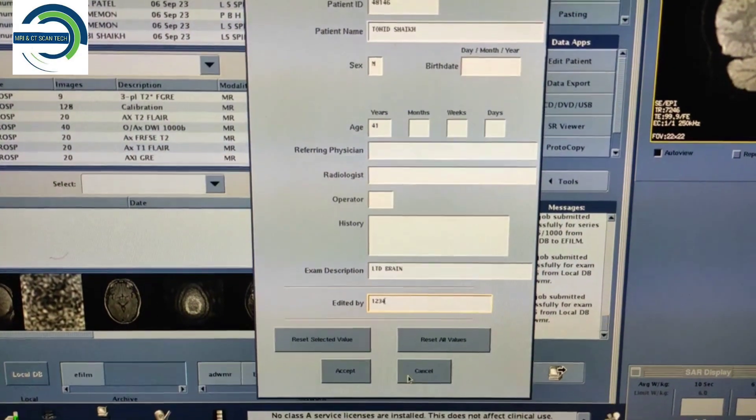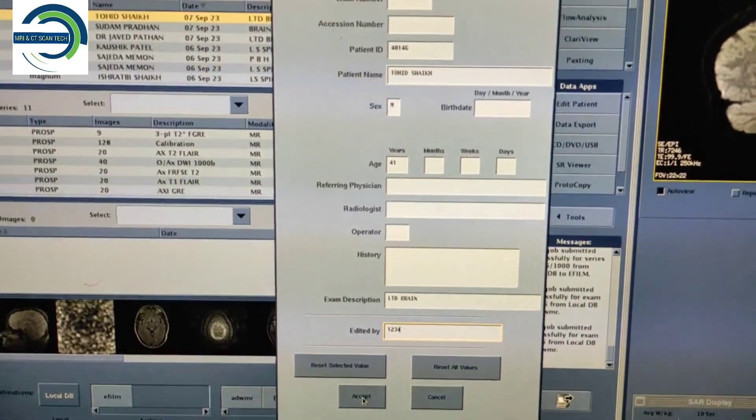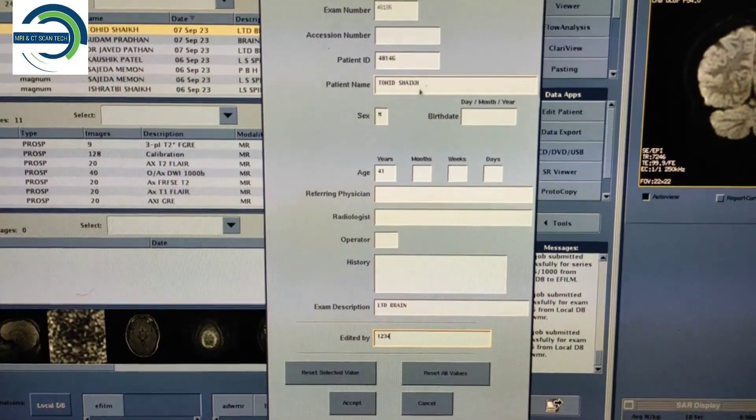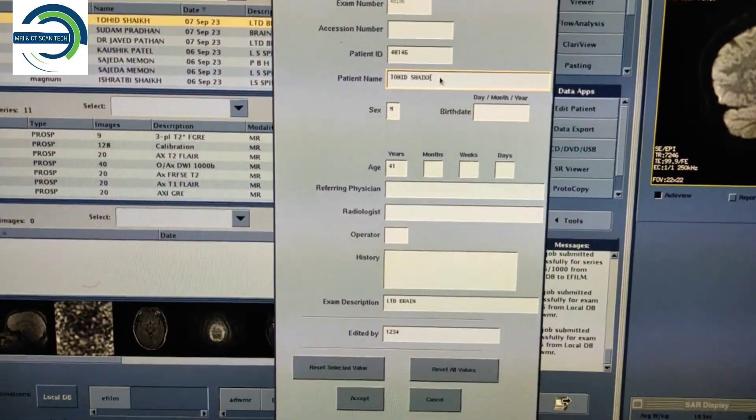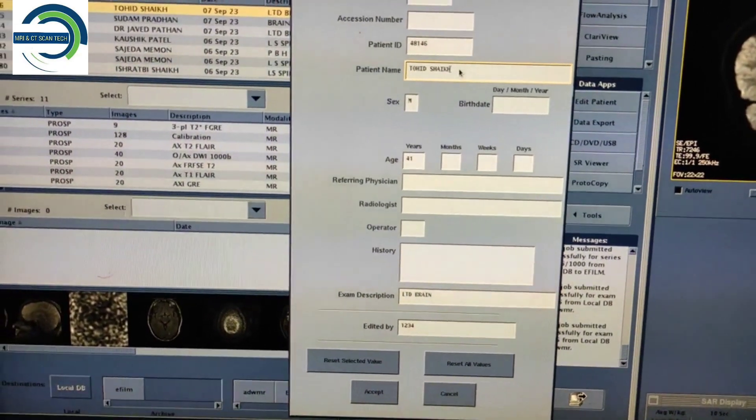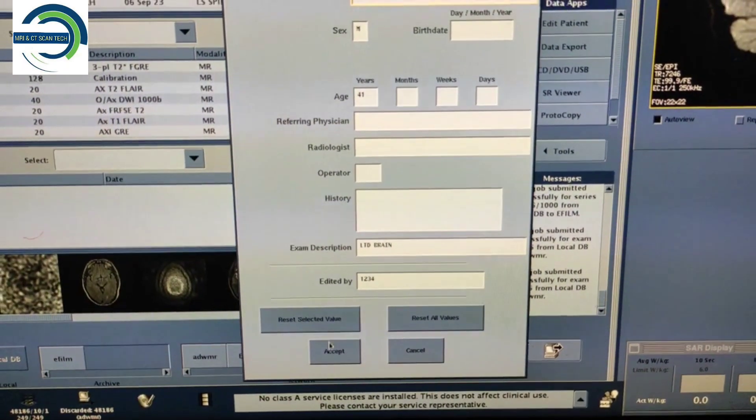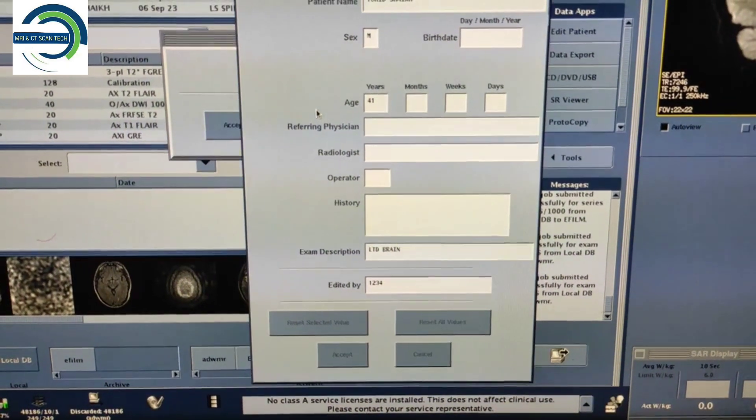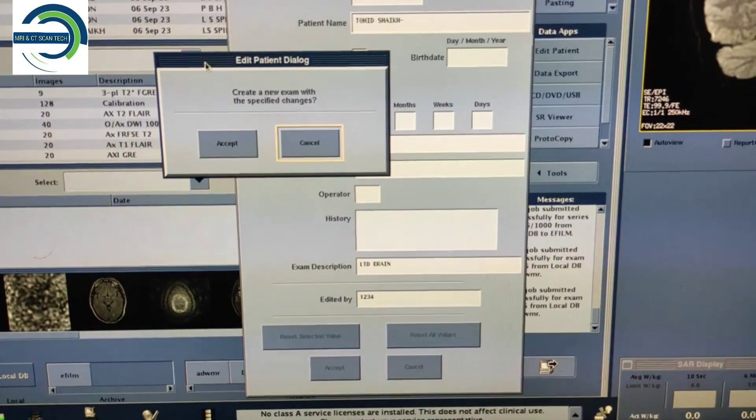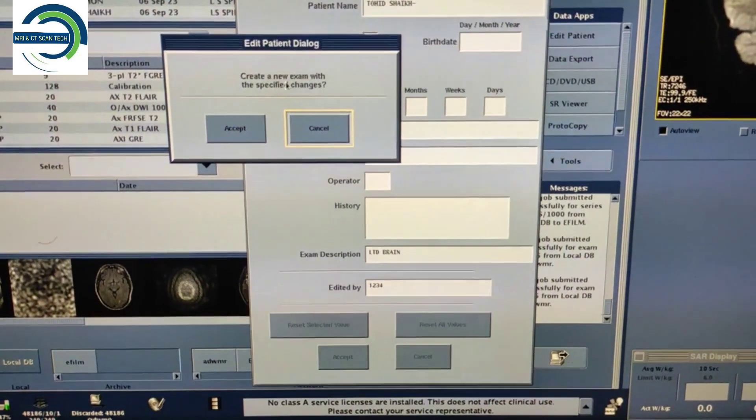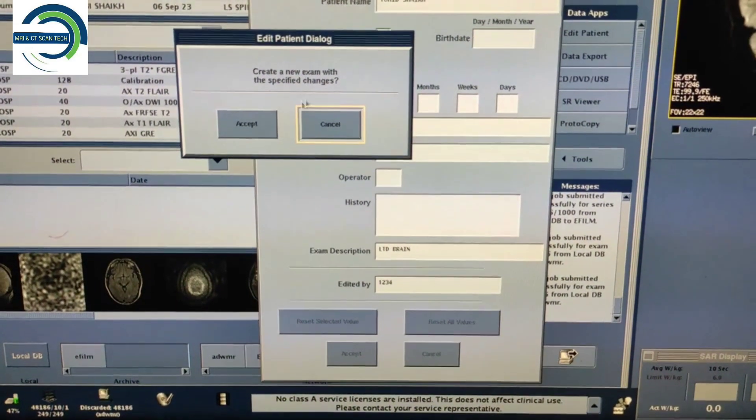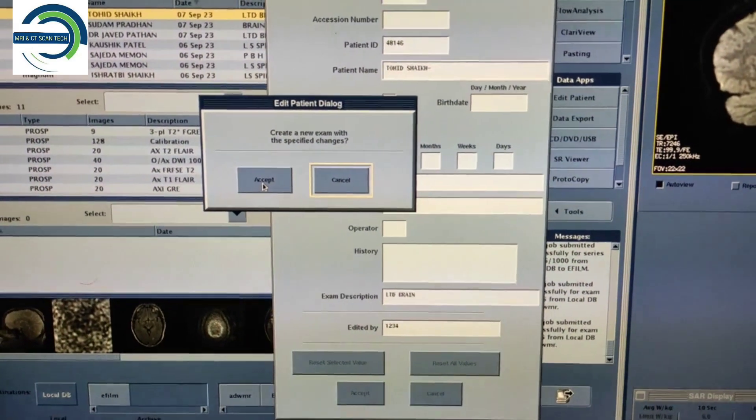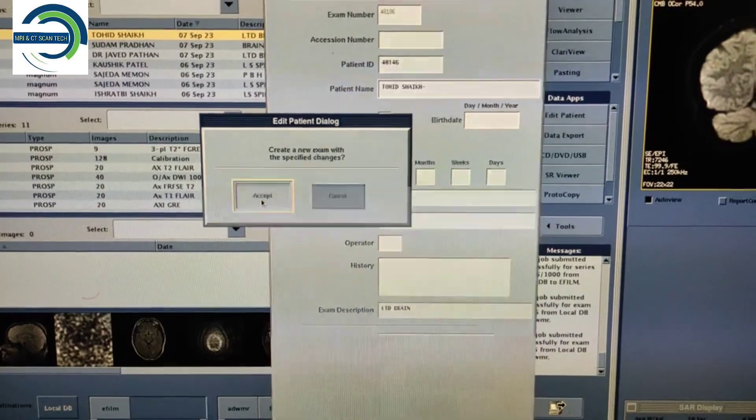Then you have to click on Accept. Again it will ask you to create a new exam with the specified changes, you have to click on Accept.